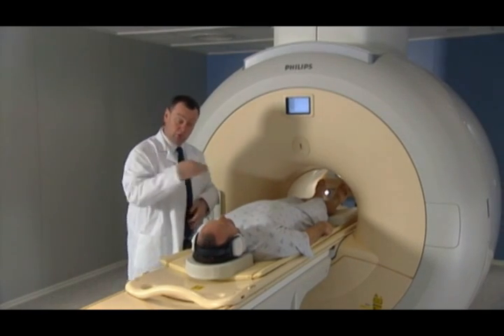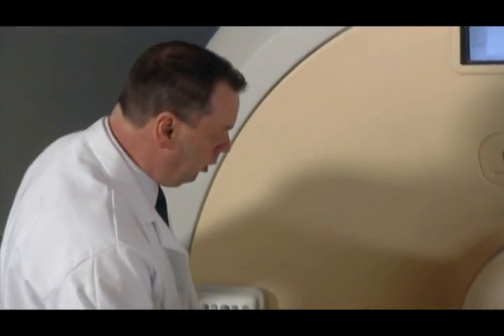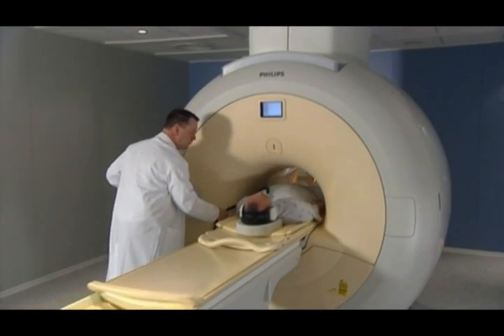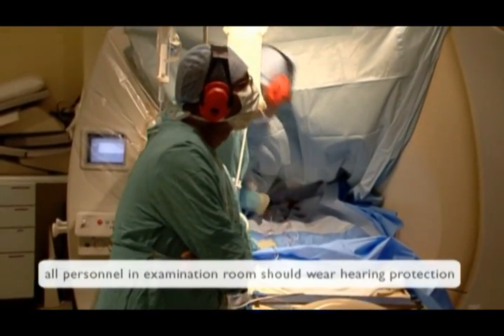The amount of acoustic noise generated can approach the maximum noise level allowed, requiring appropriate precautions. The acoustic noise generated by the system is not only relevant for the patient, but can also affect the operator or other personnel present in the examination room during scanning.